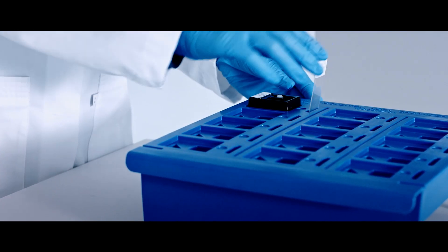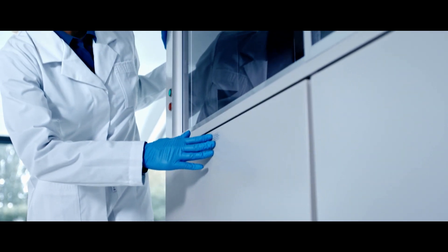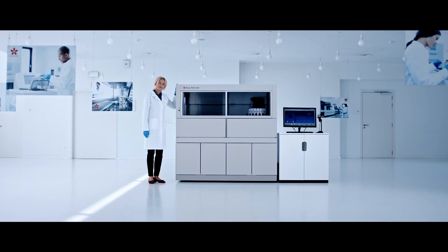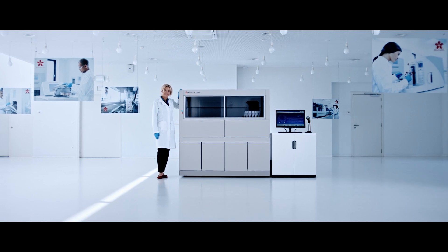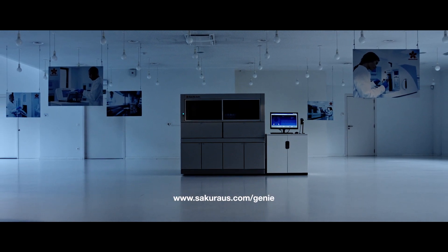It's time to work with the first and only fully automated true random access stainer for IHC and ISH. Reduce stress, gain freedom and take control to produce optimal quality slides for earlier review. Genie — uncompromisingly fast, unprecedented staining quality and predictable turnaround time. Find out what Genie can do for you. Discover your benefits at sakuraus.com/Genie.